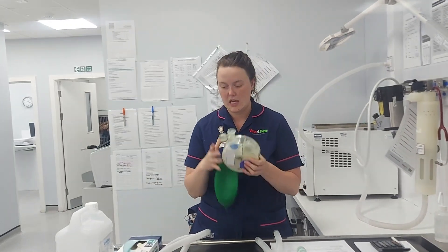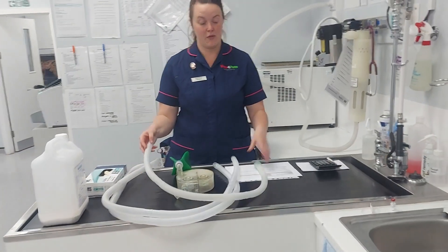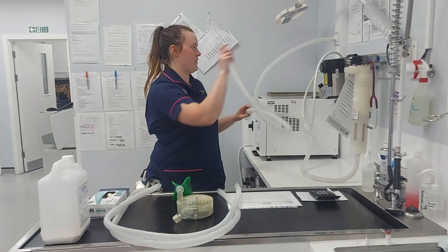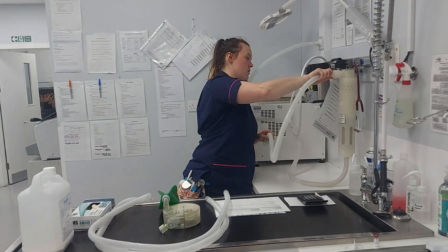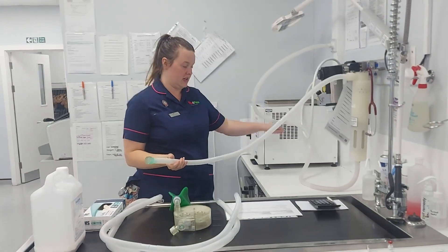Gloves on, apron on, and of course your mask. You then remove those and place them in clinical waste — they do not need to be left on once the soda lime is in and sealed. You can take them off again, and then it follows the same principles. With our anaesthetic circuit, you will have a fluorosorber below the level of the patient, attached with scavenging. Ours is an active system.